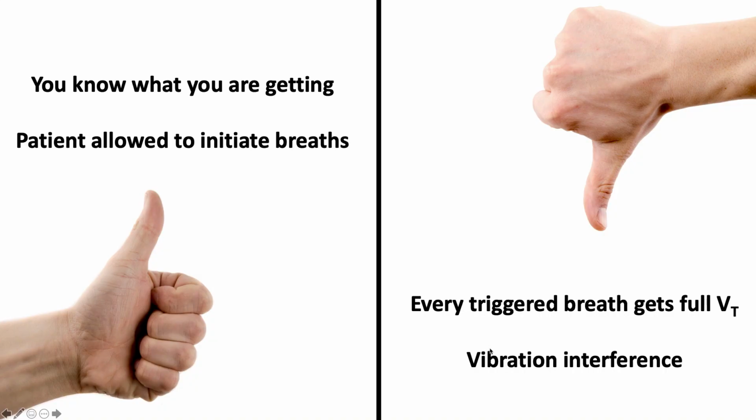Now, there's ups and downs to every mode. With assist control in general, you know what you're getting. So you dial in the components, the parameters that you want. That's what the machine's going to get. And the patient is allowed to initiate their own breaths. Now, some of the downsides: every breath gets a full tidal volume.